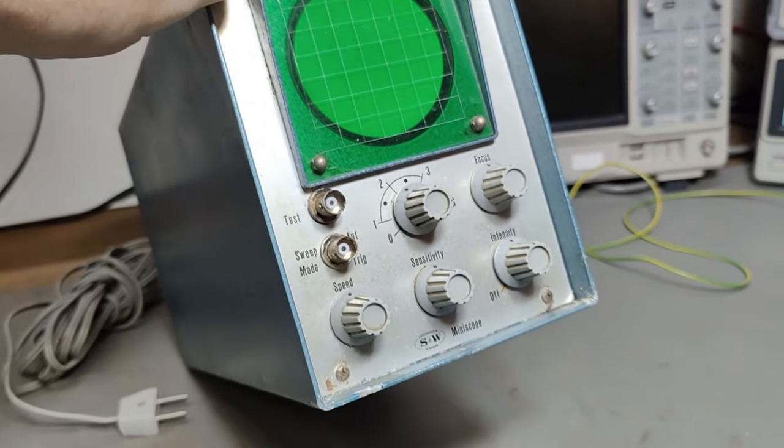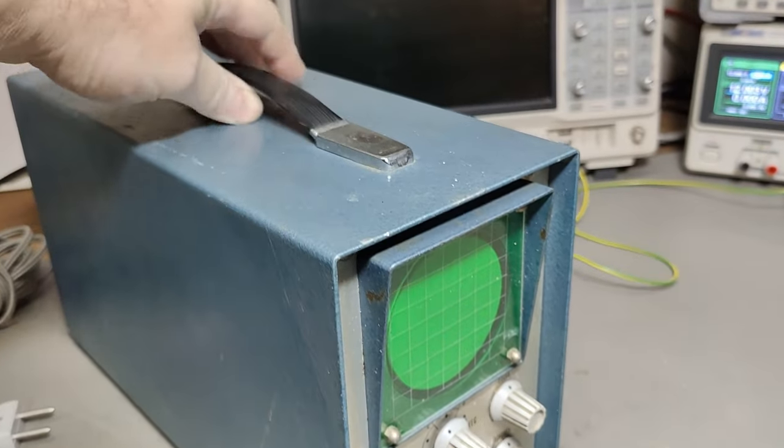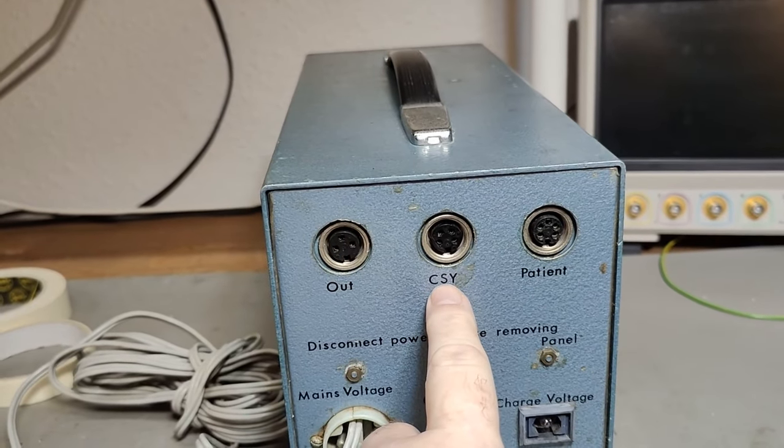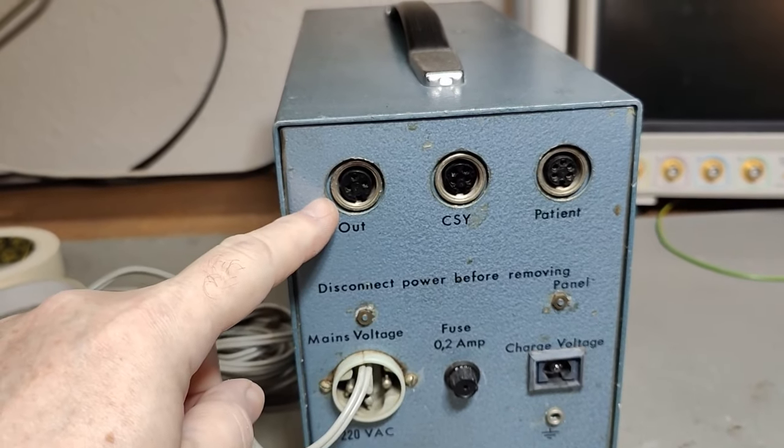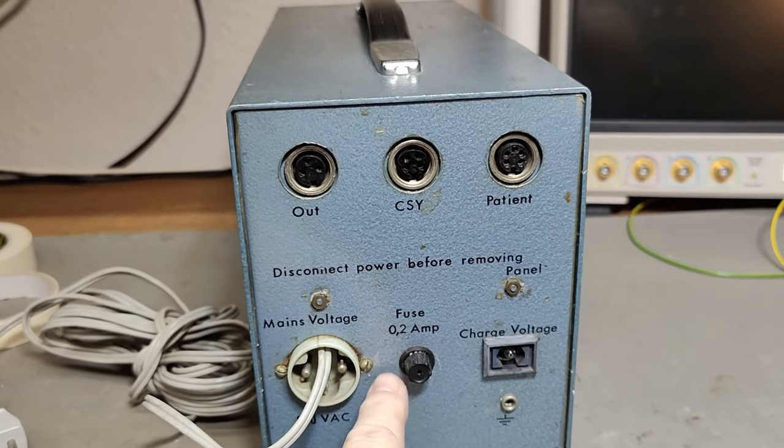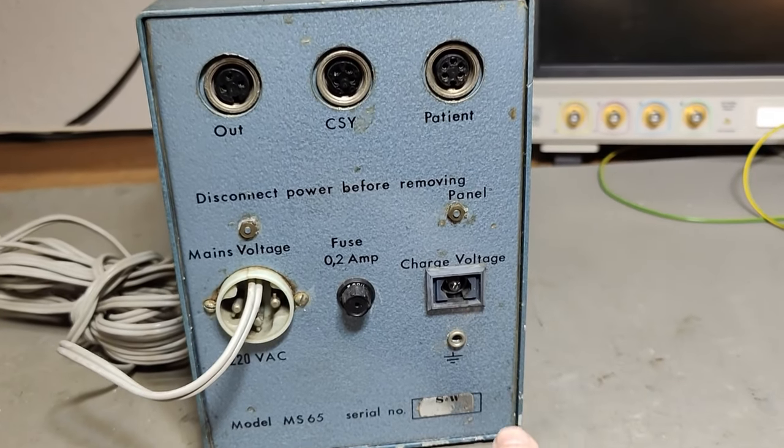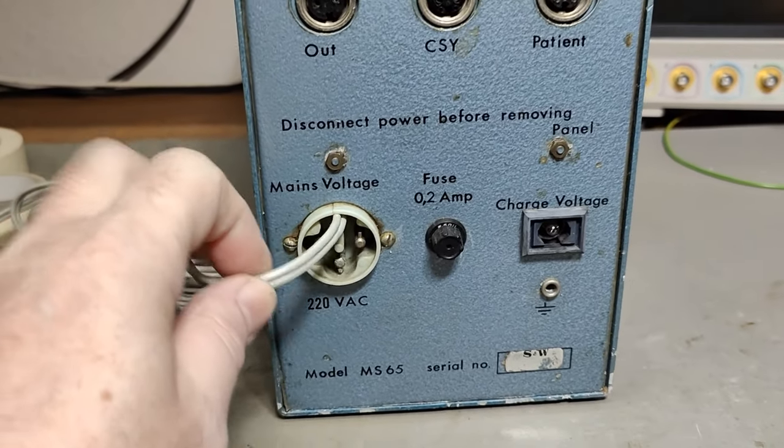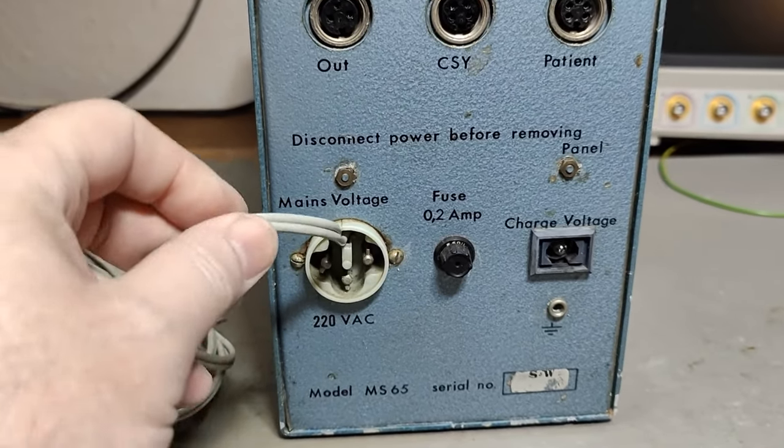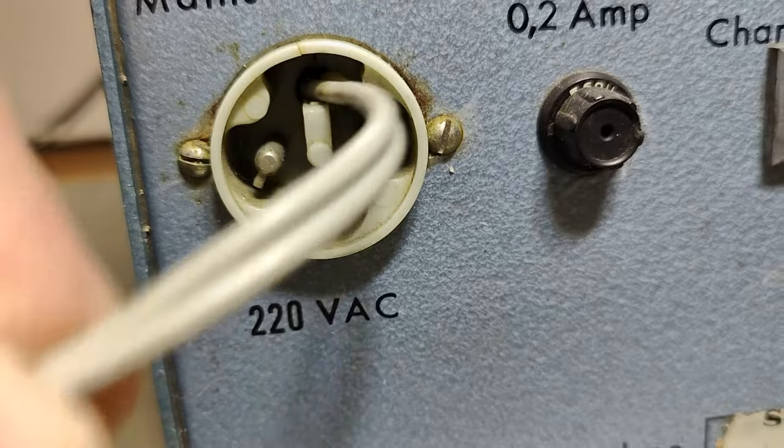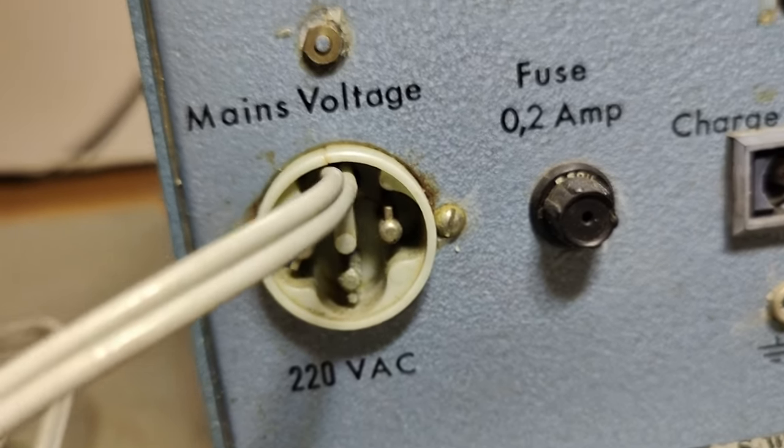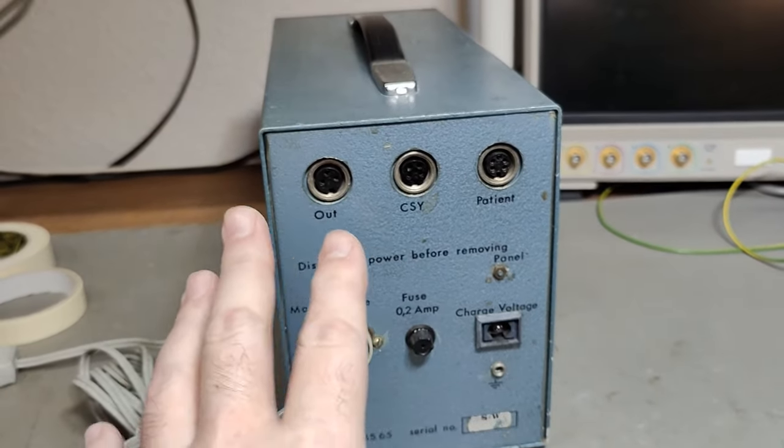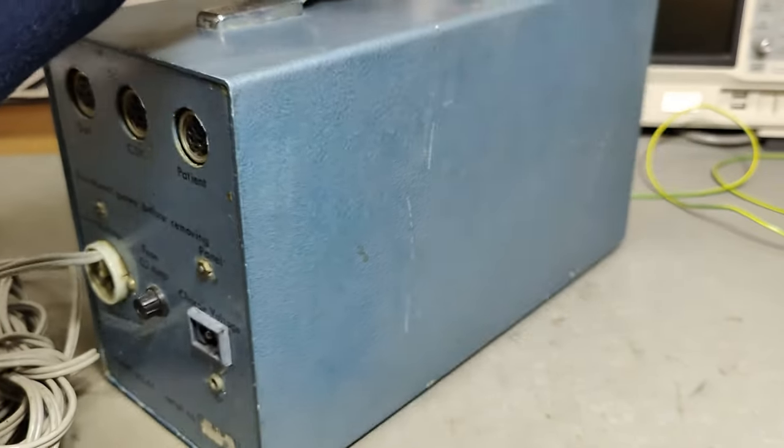Look, it is very, very old and quite heavy actually. We got some patient input, CSY output, fuse, charge voltage. The model number is MS 65. Look at that funny, funky mains power connector, and somebody modified this. It's quite a nice modification that would definitely work. I'm a little bit worried about this charge voltage, so my first move is definitely let's open this and do a little bit of inspection.